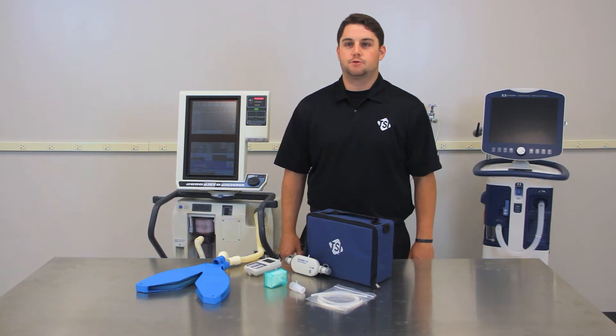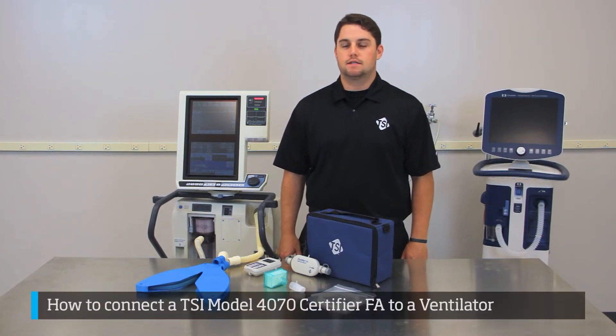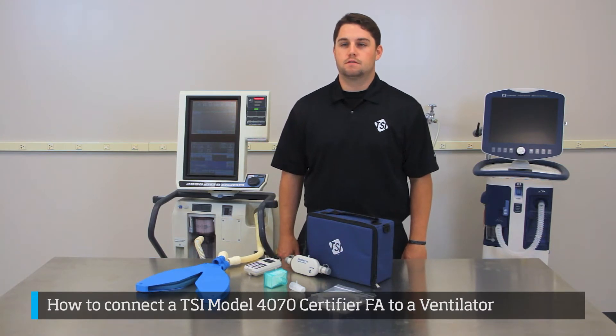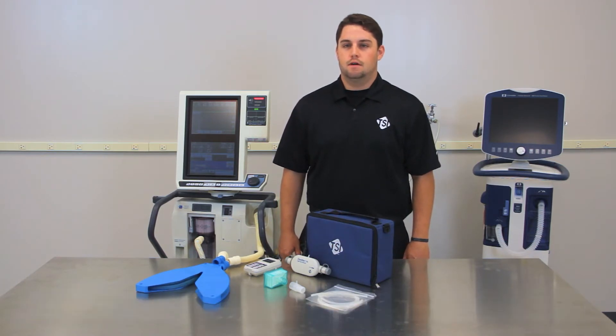Welcome. In this TSI training video, you will learn how to connect the TSI Model 4070 Certifier FA to a ventilator. When connected properly, this ventilator test system helps to measure multiple parameters of ventilator performance with high accuracy. Better understanding how the Certifier FA is correctly used will help reduce the potential for delays and help you get the job done quicker.